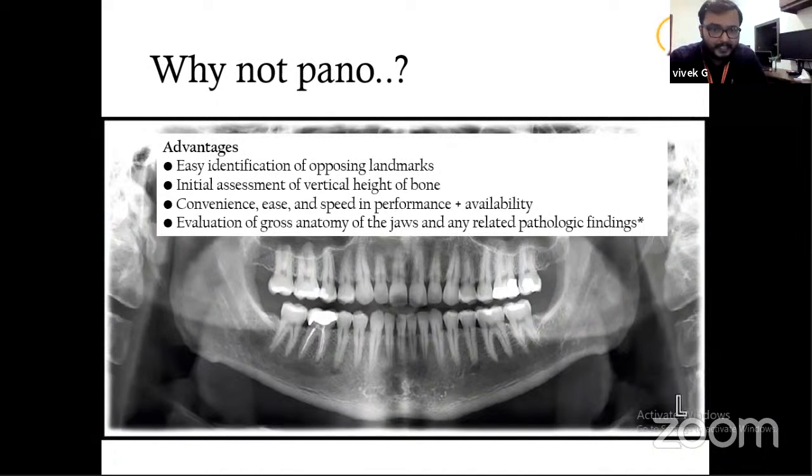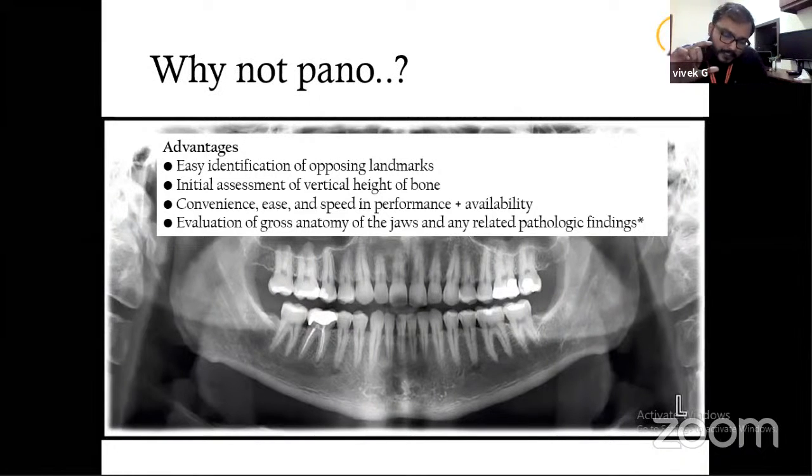It's a very good screening radiograph for the initial assessment of vertical height of the bone. The initial assessment can be done. The keyword here is initial.